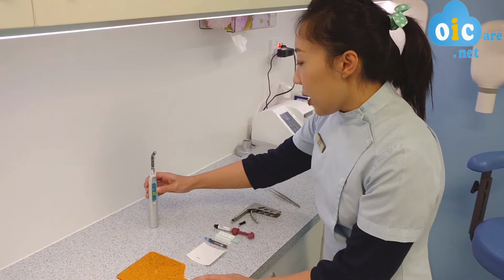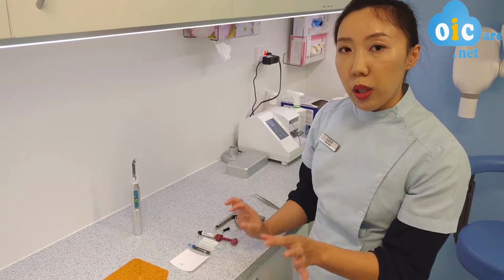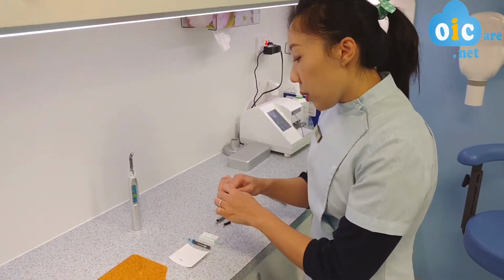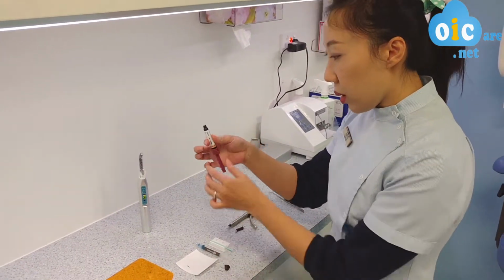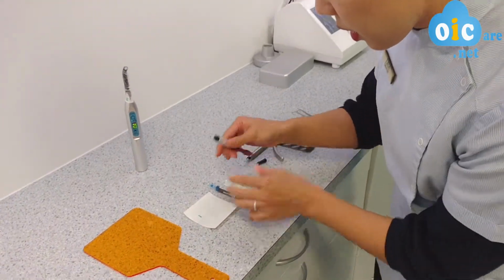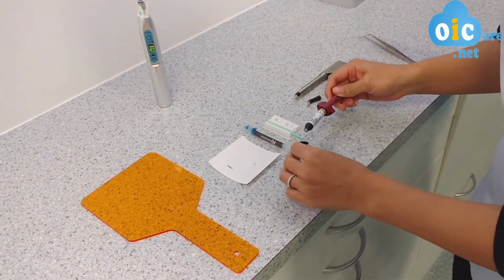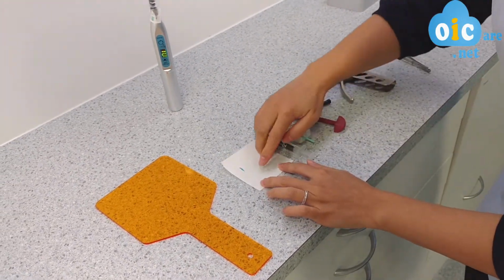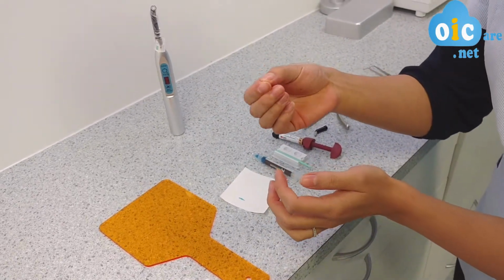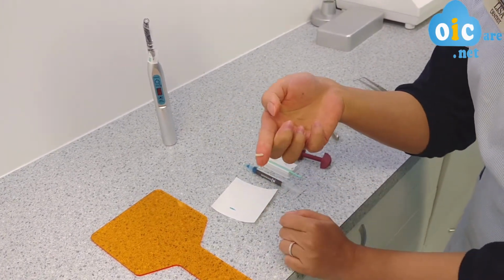After we paint the glue on, we'll start to put the filling material, the composite resin material, in layer by layer. The composite resin comes in what we call sausages, like this. We squeeze a little bit out just to show you what the consistency is like. You can see it's very pliable, like Play-Doh. I can shape it into whatever shape I want, like this.